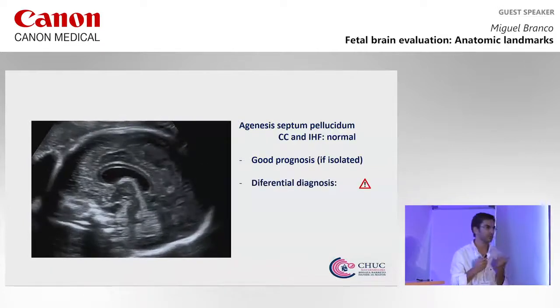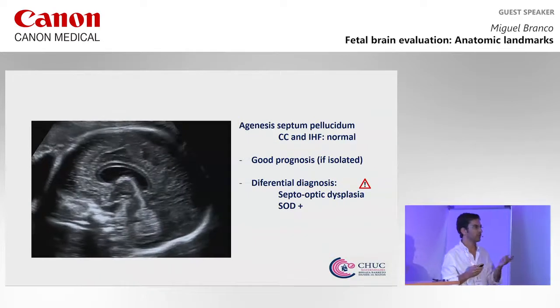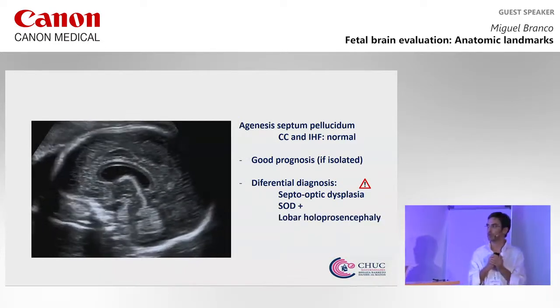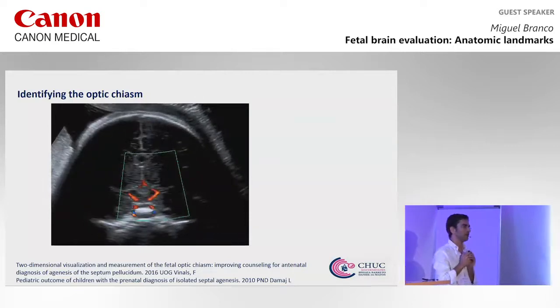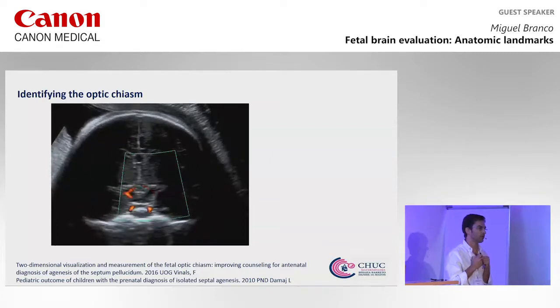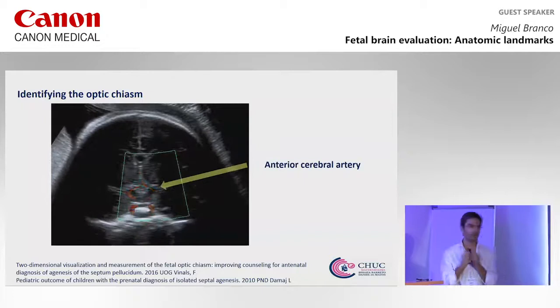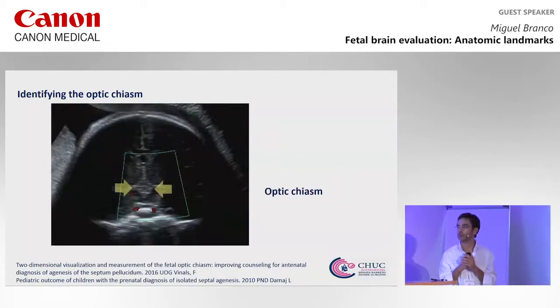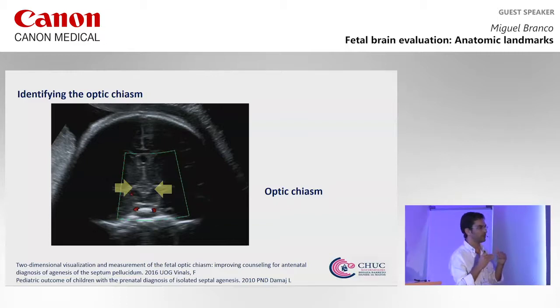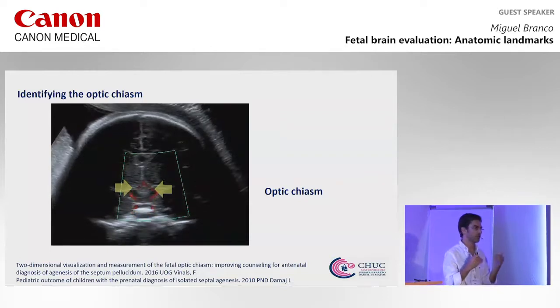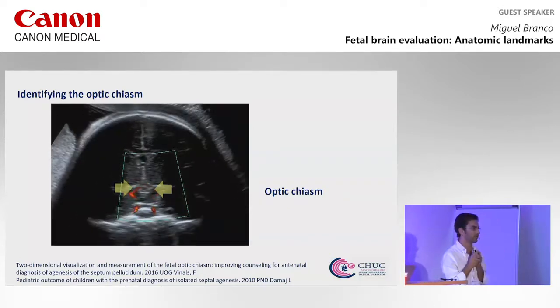But we must also discuss differential diagnoses like septo-optic dysplasia, septo-optic dysplasia plus malformations of cortical development, lobar holoprosencephaly, or disruption of the septum pellucidum. We can identify the optic chiasma on prenatal ultrasound. The easiest way, as described by Vinales, is on coronal approach: we take the anterior cerebral artery as a landmark and the optic chiasma is between the two yellow arrows. Bear in mind that a normal optic chiasma on prenatal ultrasound or MRI does not completely exclude septo-optic dysplasia, so it's still a difficult counselling situation.